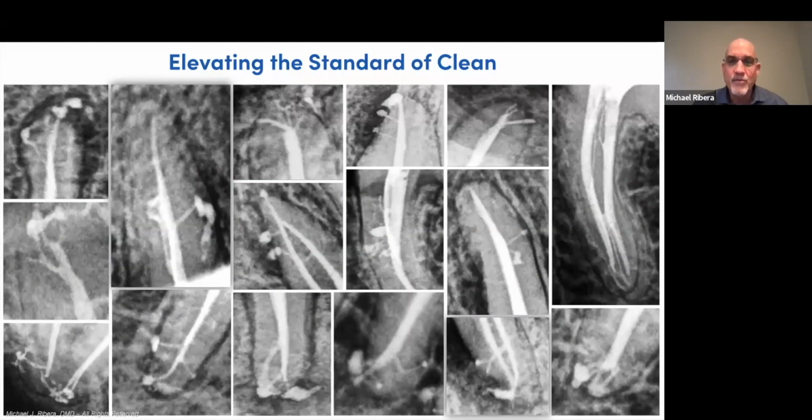Resilient, horrible, spongy, irreversibly inflamed collagen. We're no longer flirting with parts of the root canal system. We are taking it all out. And believe me, ladies and gentlemen, I am not showing off skill or ability. I am not more skillful than anybody out there. I promise you that, because I'm not showing off skill, but I am certainly showing off technology.